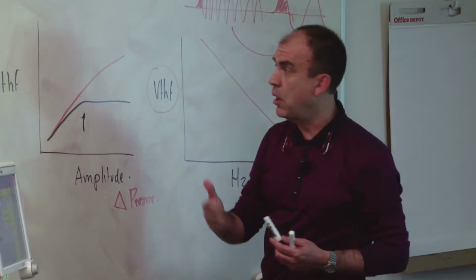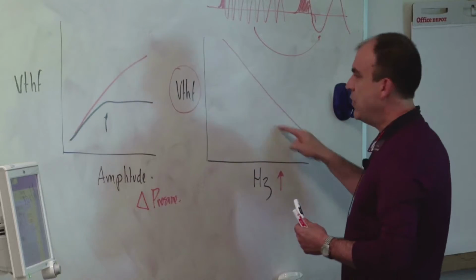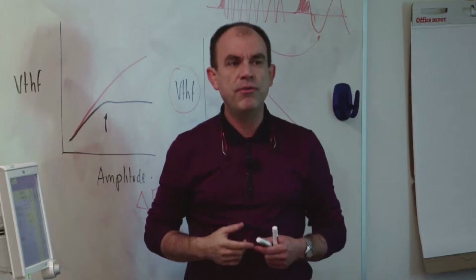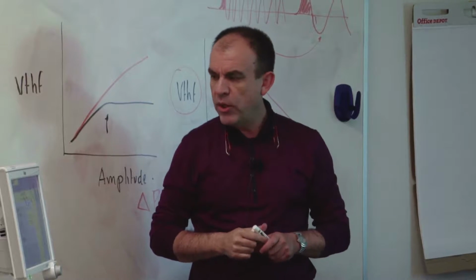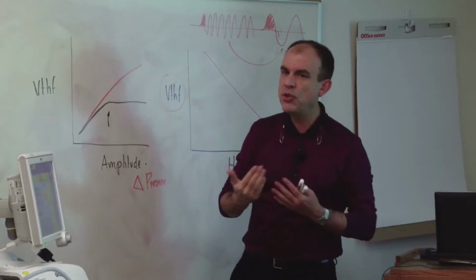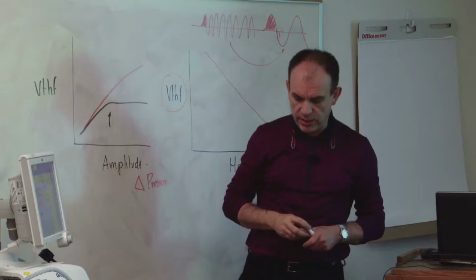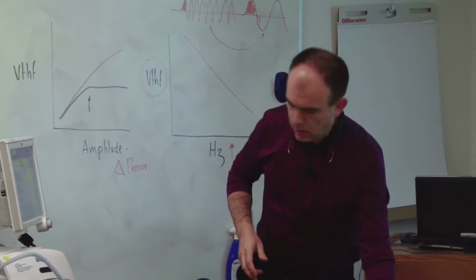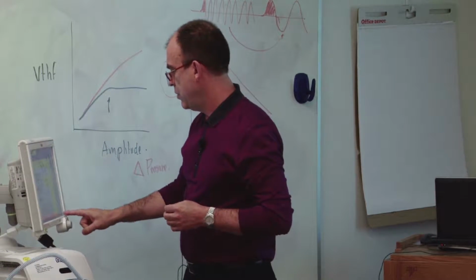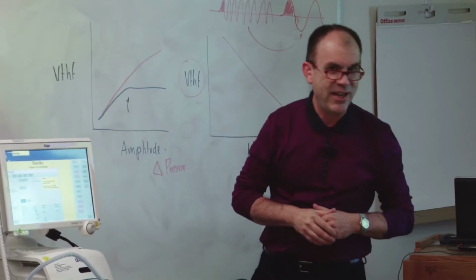So your choices are to lower your frequency, take advantage of this relationship if you want to actually increase your VTHF. So we're going to try and see that in practice and the relationships that you have between all the parameters in these type of ventilators. So let's turn it on.